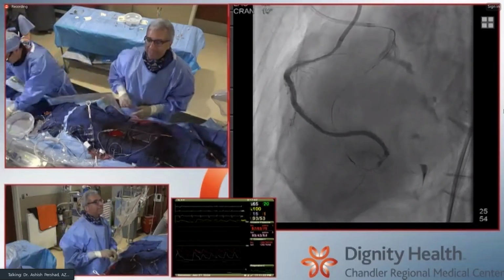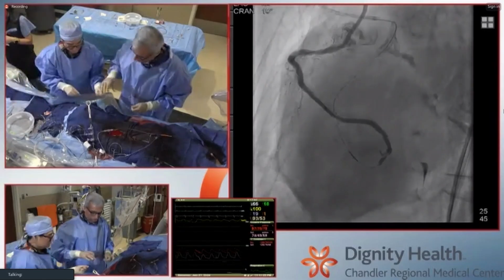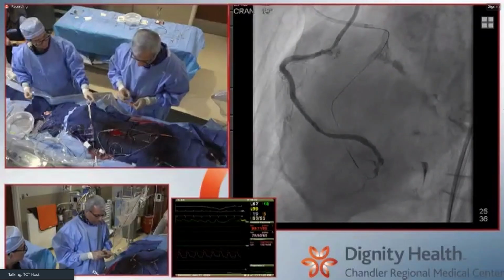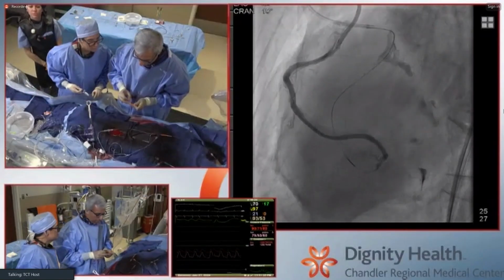to look at that mid segment that the Co was talking about. We're all excited to see what that mid segment will look like because it's such a difficult problem to solve.